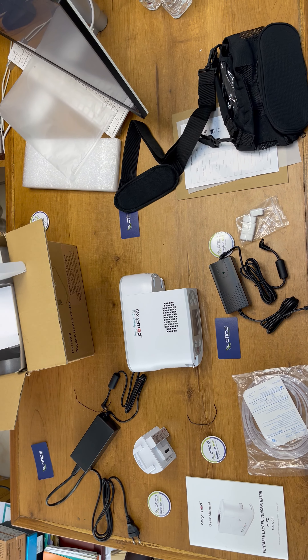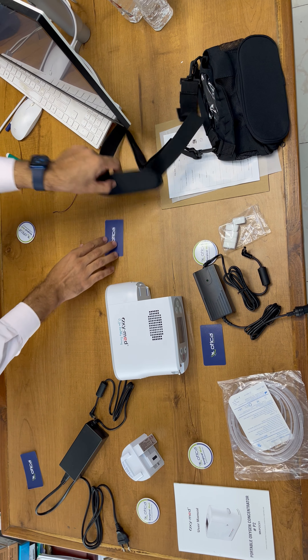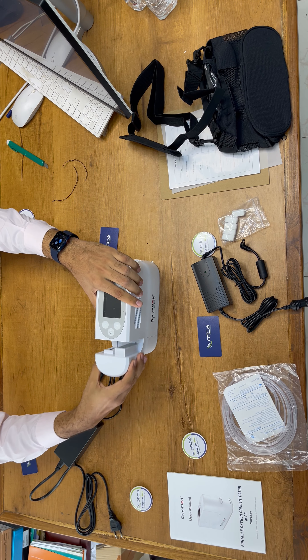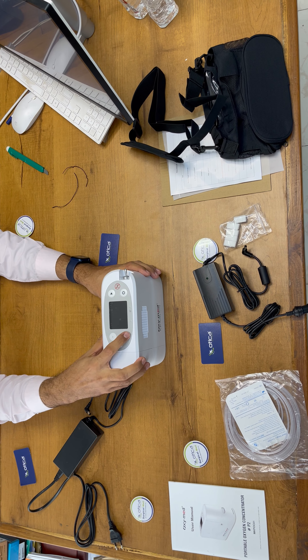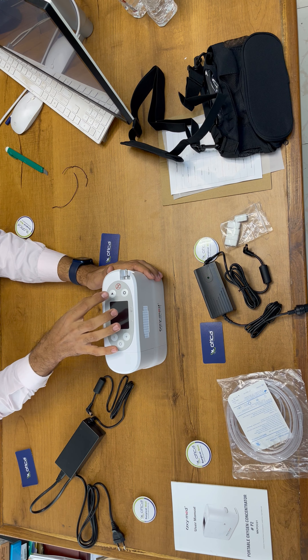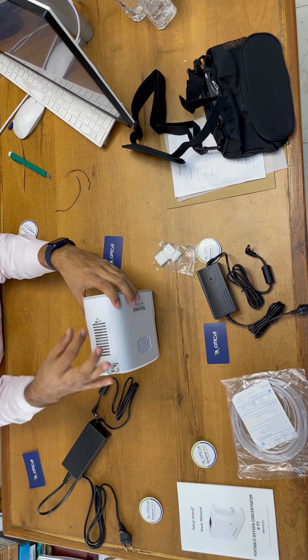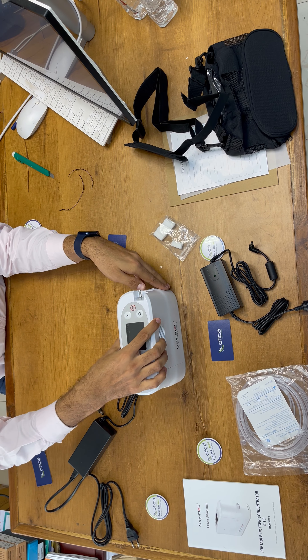We are putting the box and packaging material aside so we can have a proper demo of the machine. This is the main device. We have to connect this battery — we have to slide it in like this, and it will lock in place. Now the battery is attached. This is the power button, plus and minus for the flow rate, this is the menu, and this is the alarm button. This is the filter window — after one or two months of usage you need to replace the filter by opening it with a screwdriver, removing the old filter, placing the new one, and closing it.